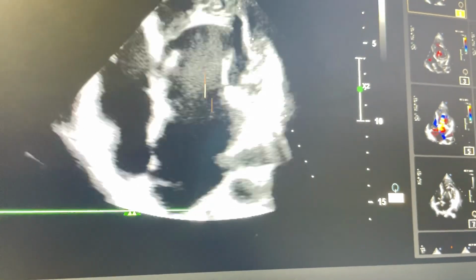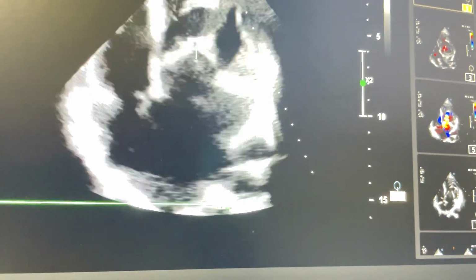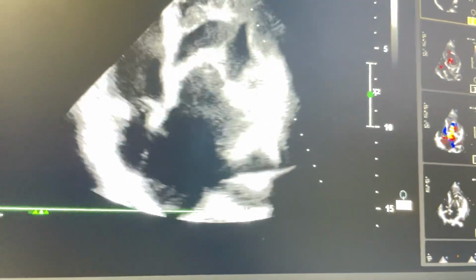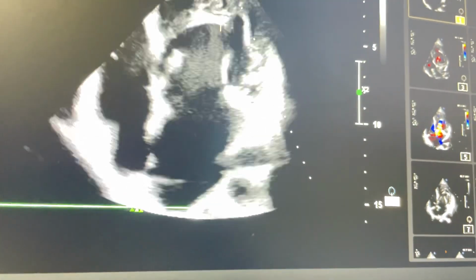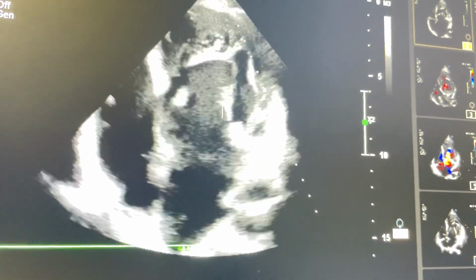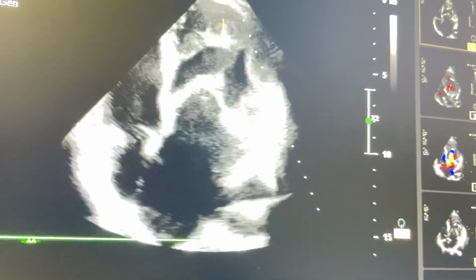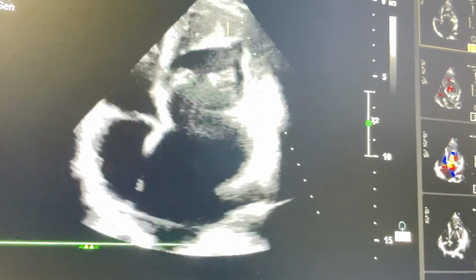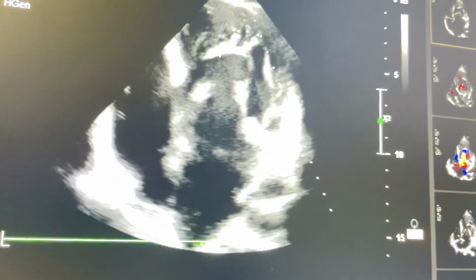From left atrium, right ventricle is coming. You can see that this is tricuspid valve because it's more apical, more close to apex compared to this mitral valve. So the valve that is close to apex is tricuspid valve. So this is right ventricle. You can see moderator band also, and the chamber is very much rough, not very smooth. You can see in this image, this is apical four chamber view.